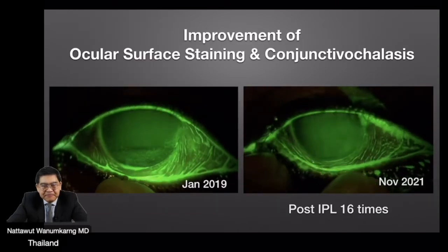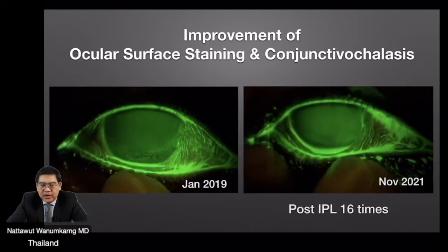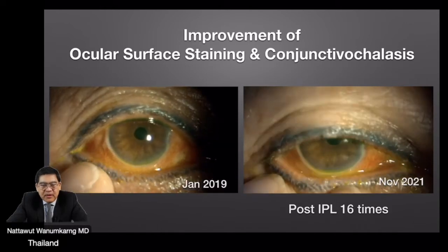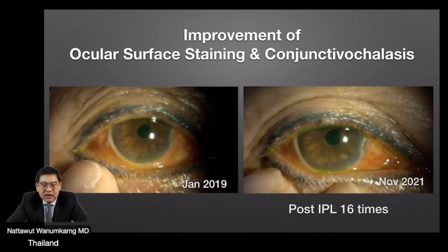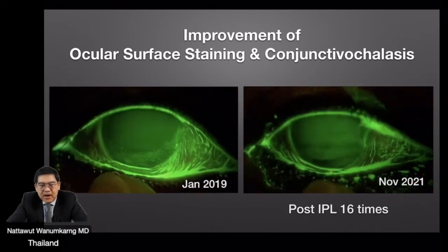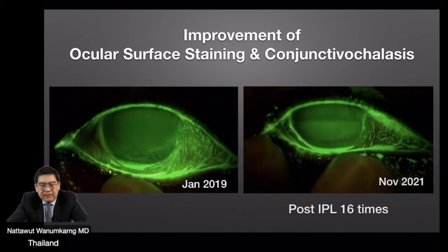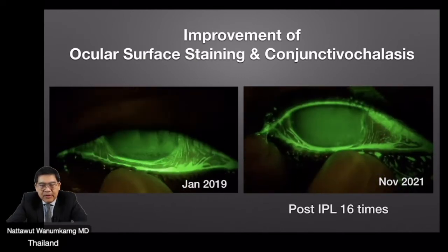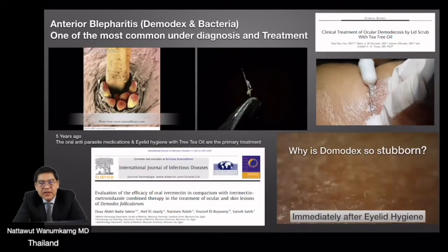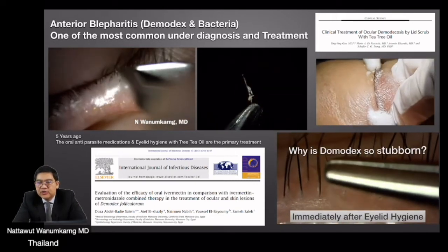In this lady, she had chronic on-and-off red eye, tearing, and subconjunctival hemorrhage for the past 20 years. After 16 IPL treatments, we observed with microscope videography a marked improvement of the staining on the cornea and a marked improvement of the degree of conjunctival chalasis. Anterior blepharitis caused by Demodex and bacteria is one of the most commonly underdiagnosed and undertreated conditions.